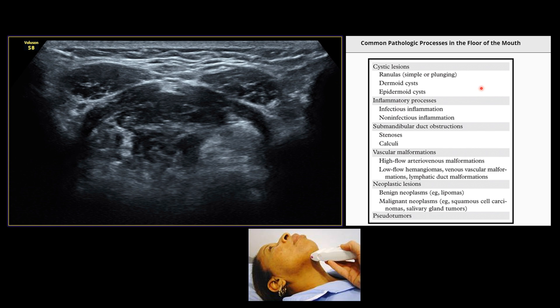The common cystic pathologies we can encounter are ranulas, dermoid cyst or epidermoid cyst, which are cystic lesions, inflammatory or non-infectious inflammatory processes, sometimes sialolithiasis or calculi causing obstruction, high-flow arterial venous malformations, low-flow venous malformations, lymphatic malformations, and venolymphatic malformations.